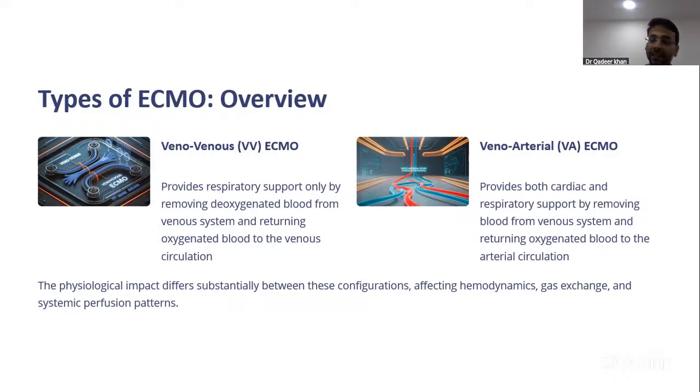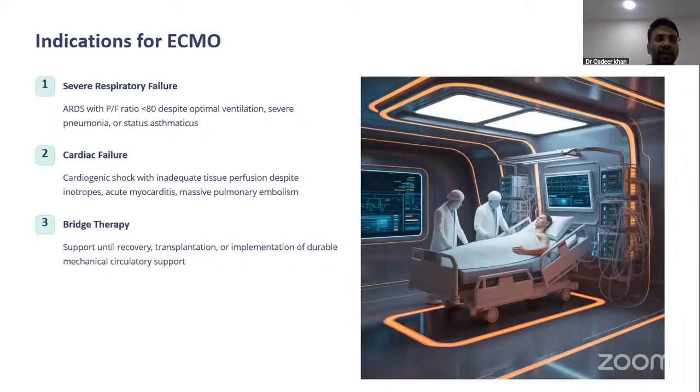The physiology we're talking about is usually far different from the normal physiology of the body. The normal physiology will not be the same as the ECMO physiology. I've already told the indications: respiratory failure, cardiogenic shock, and it can also be used as a bridge therapy.